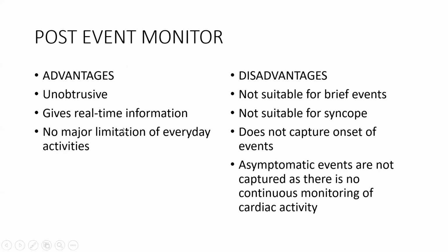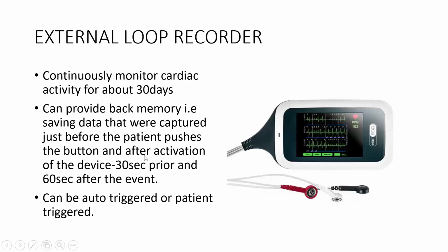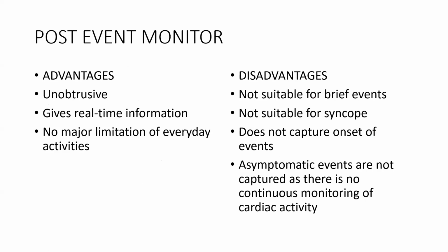It does not affect activity of daily living. Patients can go about their activity, and information is transmitted in real time.